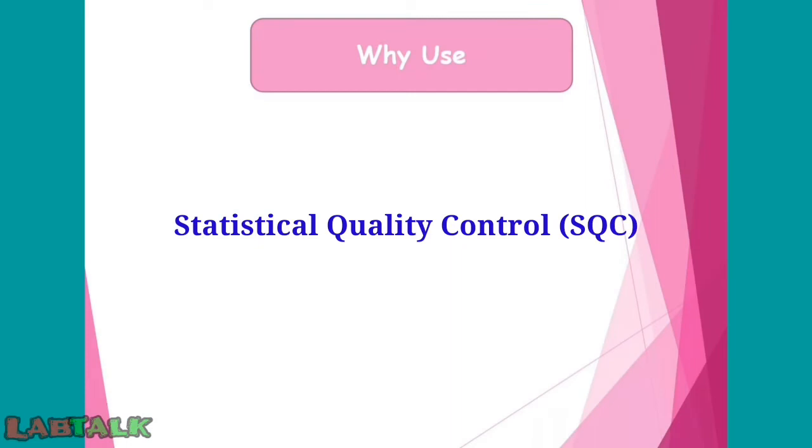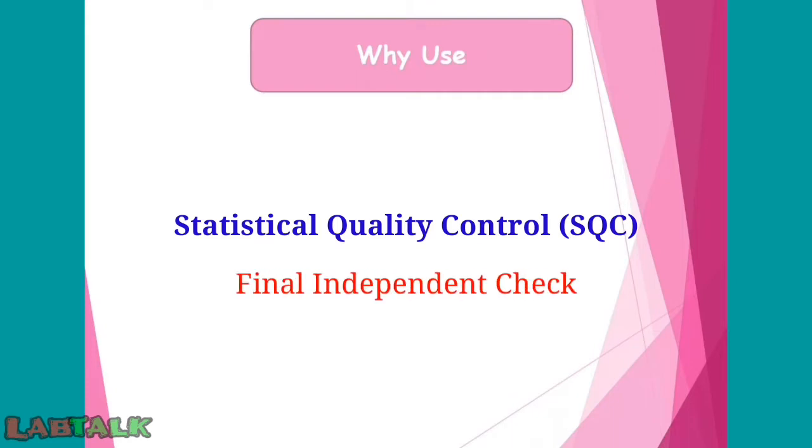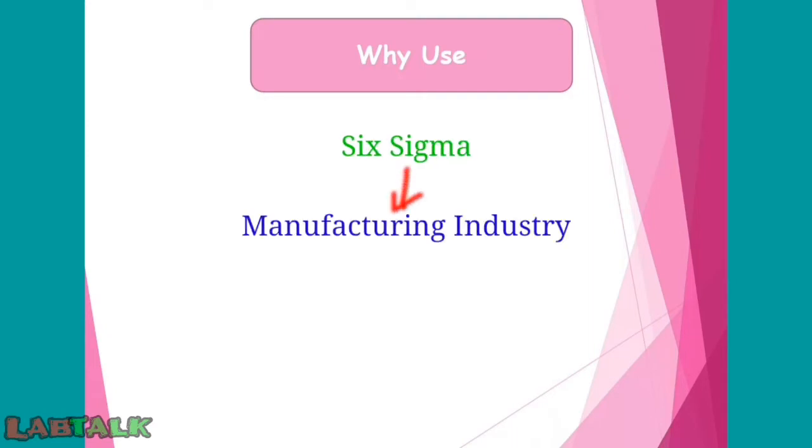Statistical quality control is an essential lab practice to ensure reported results achieve the quality required for intended medical use. Modern highly automated systems provide many function checks to ensure proper operations. To produce accurate results, no analytical system is perfectly stable. So laboratory needs statistical quality control to provide a final independent check to detect performance changes potentially causing medically important error.